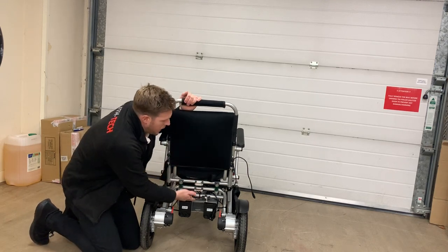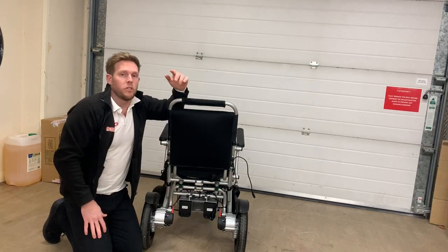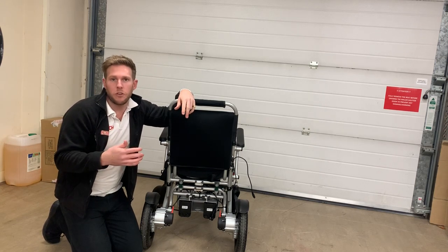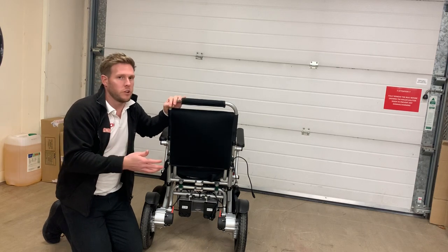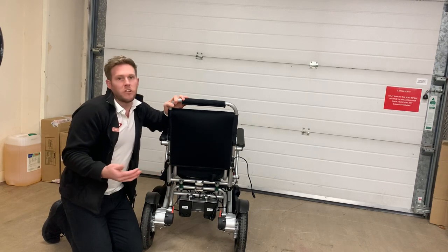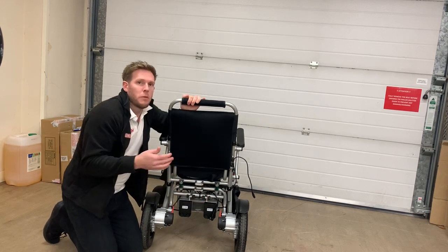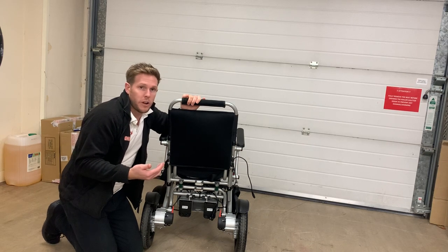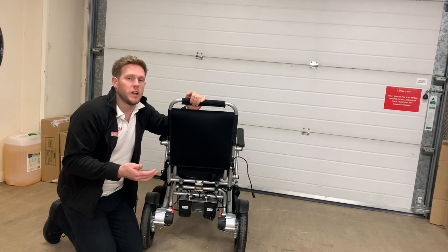The batteries provided with this chair are one 10AH and one 6AH. We went for one of each because the 10AH gives you much more range — so you could use the 10 for everyday use — but we also provide the 6 so you can swap between them. The 6AH can be taken on every airline in the whole world, whereas the 10AH can mainly only be taken on long-haul flights with providers like British Airways and Virgin.